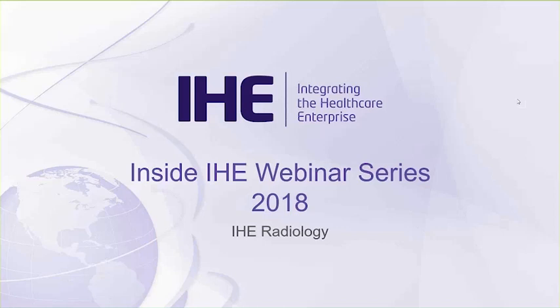And for those that are a little bit unfamiliar, today's DICOM-based solutions work really well for what they're designed to do: transfer images from one system to another, but they don't work so well for on-demand access and interactive viewing. So WIA leverages familiar web-based technologies such as JavaScript and JSON, HTTP to access these images, and Kinson will describe the profile capabilities in greater detail. And then Kinson's also going to provide an update on some significant changes to XDS.